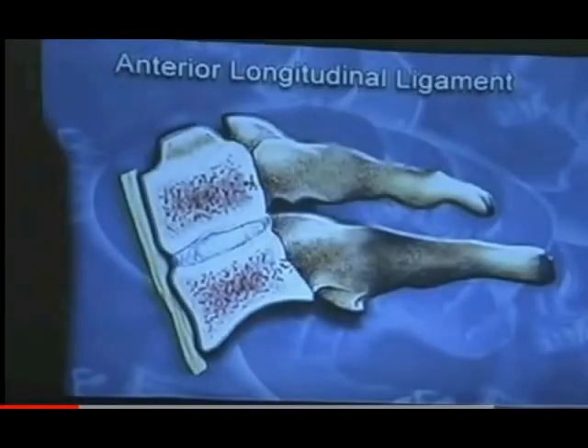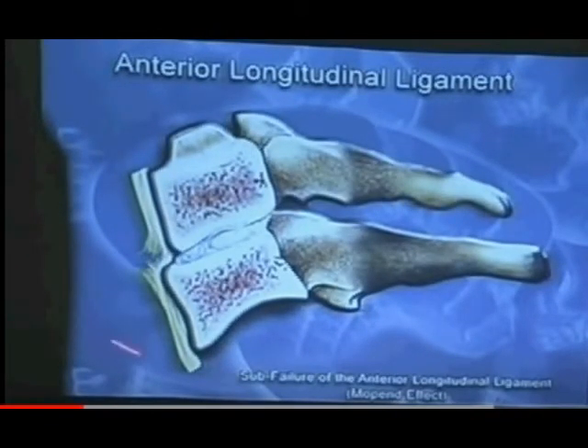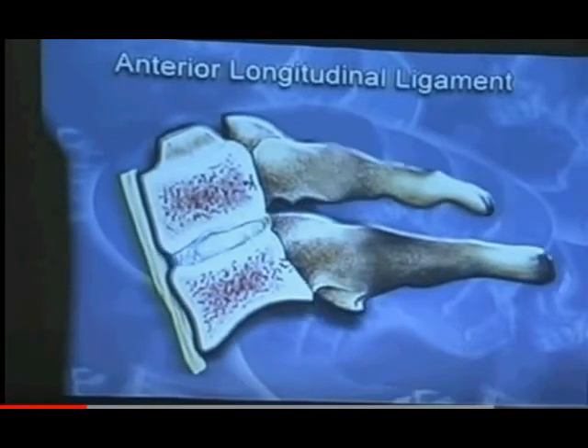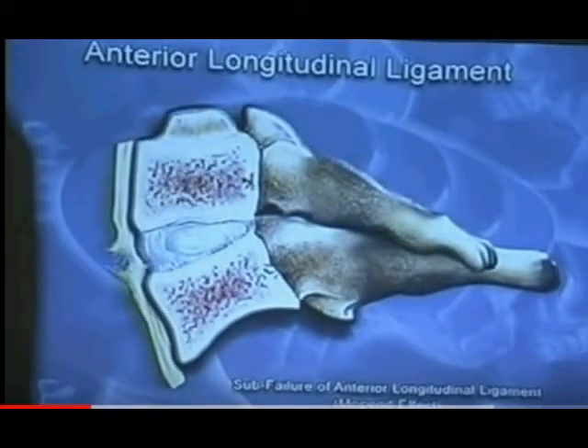Let me point out where these ligaments are, just to refresh your mind. The anterior longitudinal ligament is in the front of the bones — the bodies. When they tear, they make sounds like that, and it's called a sub-failure. Watch it again — it either shifts back or it rocks up. There we go, sub-failure of the anterior longitudinal ligament. See, it changed the disc angle.